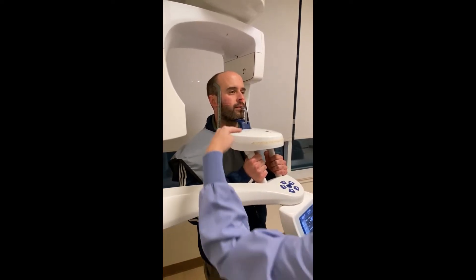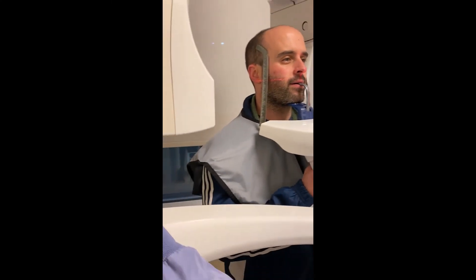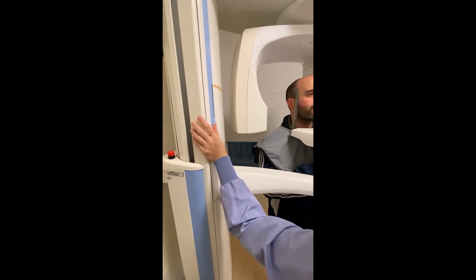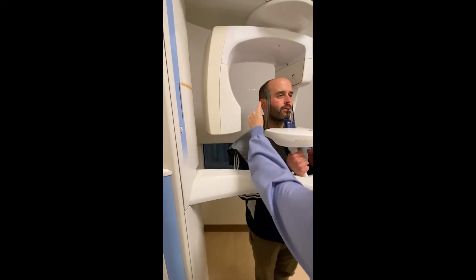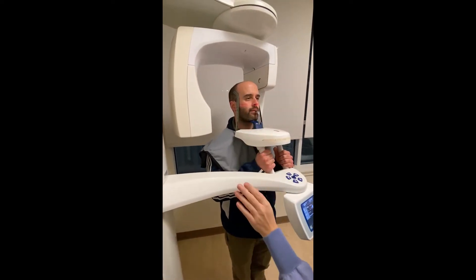The next laser to look at is the ala and the tragus laser. When adjusting this laser, it can be found on the panorex's left-hand side. Roll this laser up so that it hits the middle of the tragus and the middle of the ala, or as close as possible.